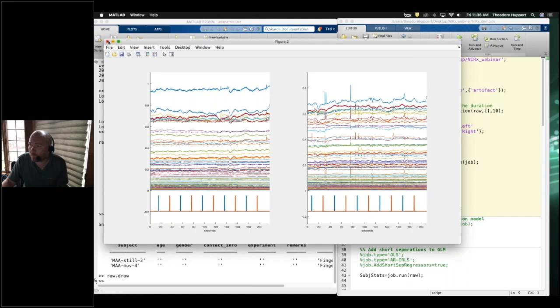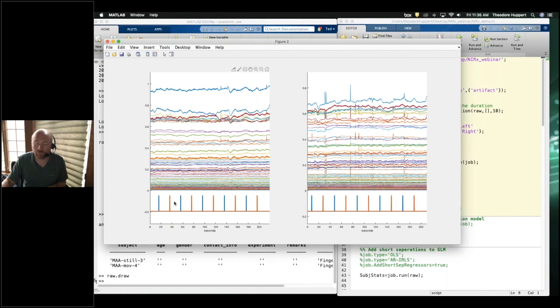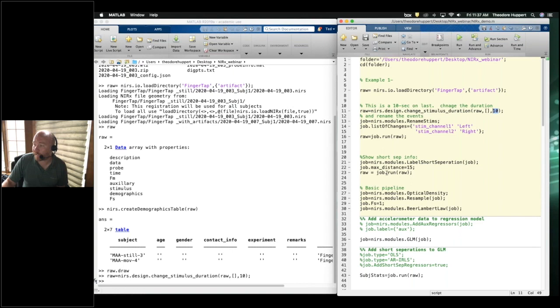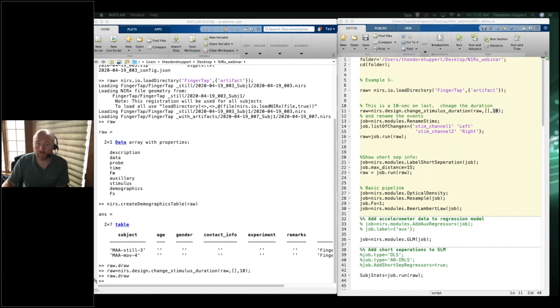For the NIRS analysis we need to fix the timing information. Right now the NirX system recorded the start of each event, but this task was a 10-second finger tapping alternating between left and right hand. We call the function nirs.design.change_stimulus_duration and change the stimulus duration to 10 seconds instead of spikes. Now when we draw it we get these 10-second boxcar events.